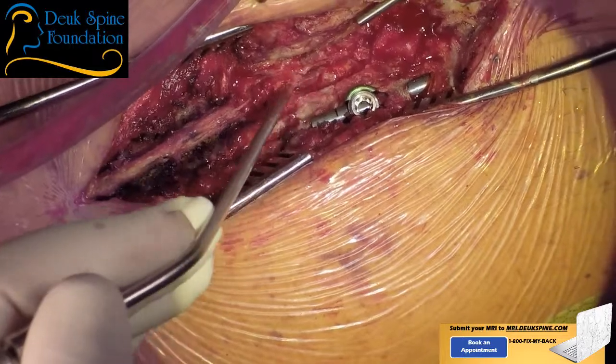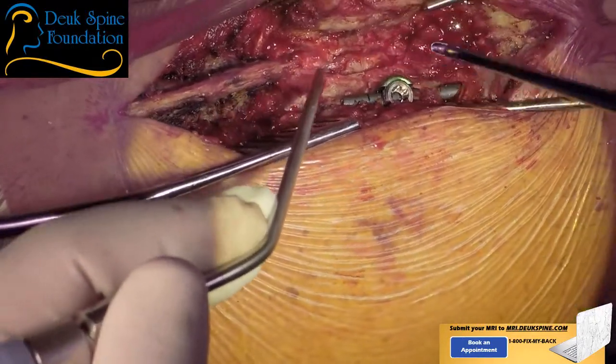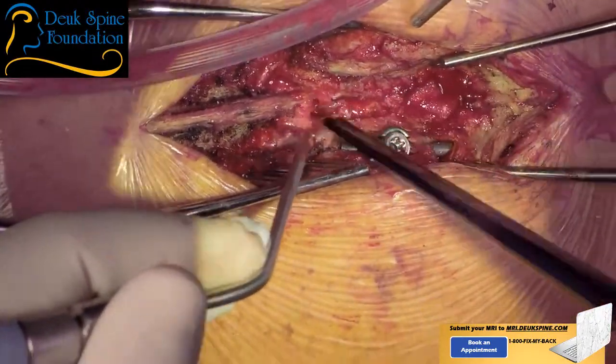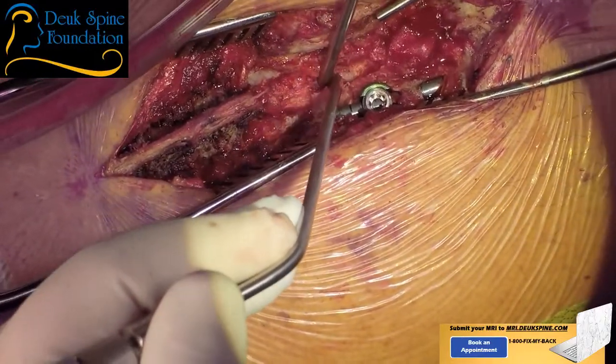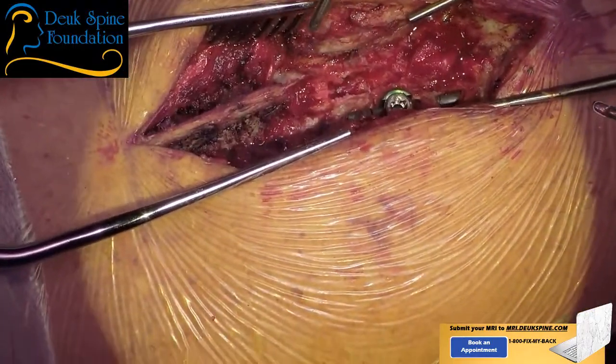Yes. So I'm getting up here at the top of the lamina, and that's the junction between one and the other. Okay. So I have a lamina here, and I got a lamina here. And this is the junction. Look at all that hypertrophied ligamentum flavum.